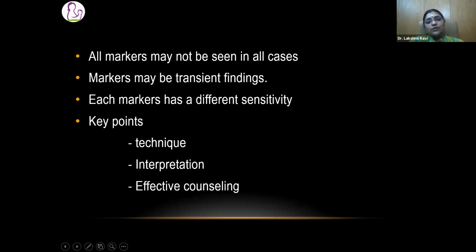Because if you see a hypoplastic nasal bone or an absent or unossified nasal bone, how do we counsel? Or if you see simply an echogenic intracardiac focus, or you see some renal pyelectasis, how do we counsel? This is very, very important. We need to understand what our stand is when we see these soft markers on ultrasound in the mid-trimester.